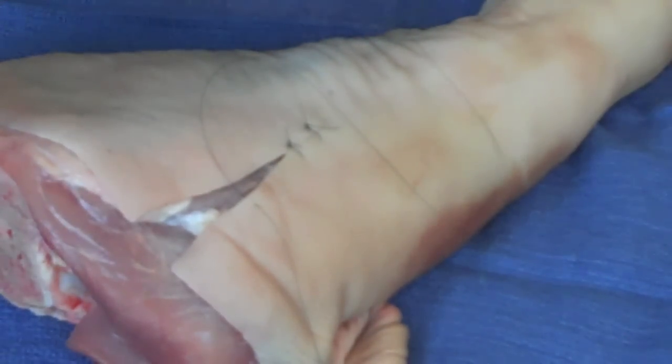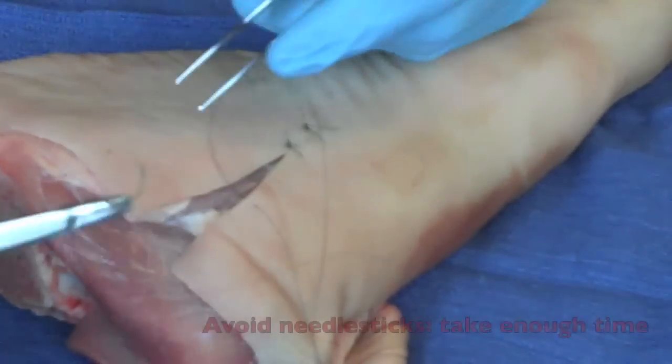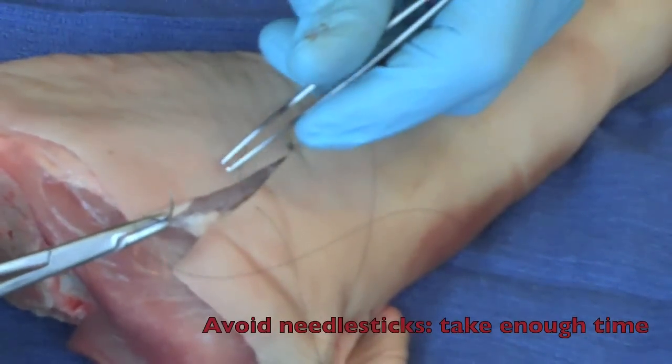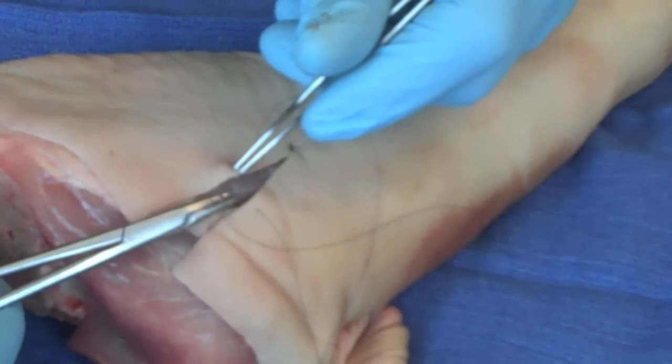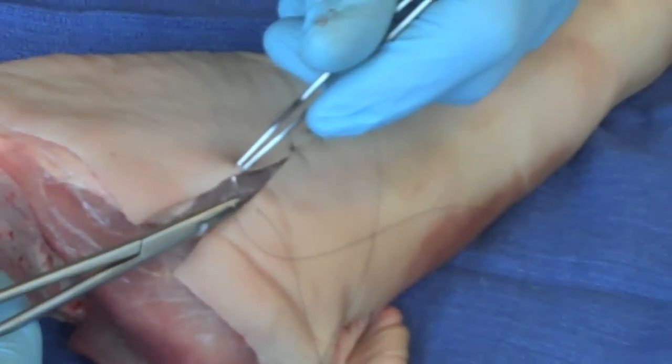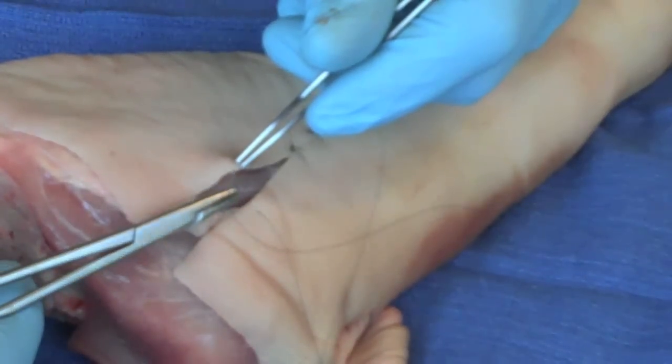I reload my needle — make sure I don't stick myself, very important to make sure you don't do that. That turns a good situation bad. I pick up the edge of the wound here, check it as a cross, same distance from the edge there. And continuing.